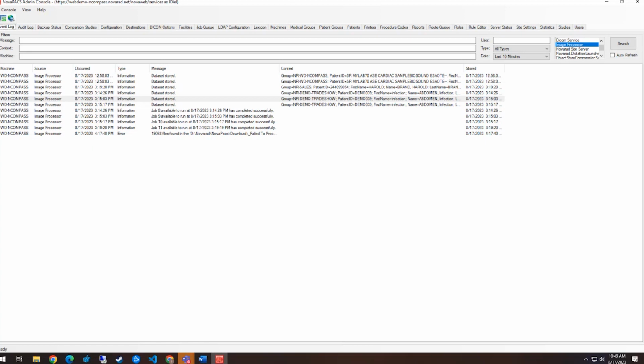You know, if you say system is slow, that is very generic and it's hard for us to look into prior to reaching back out to you. A lot of times, if it's something we can fix quickly, we'll fix it quickly, reach back out to you and say, hey, look, we got your email, we created a case, we resolved your issue, and this is what we did to resolve it. But if we're not given the information, then there's very little we can act upon.